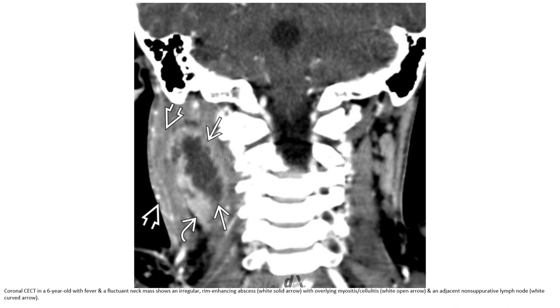This is contrast-enhanced CT in the same six-year-old with fever and painful neck mass, showing an irregular rim-enhancing abscess with overlying myositis, cellulitis, and an adjacent non-enhancing lymph node.